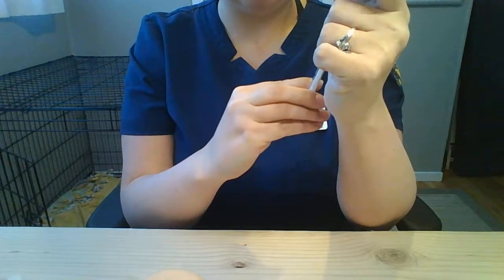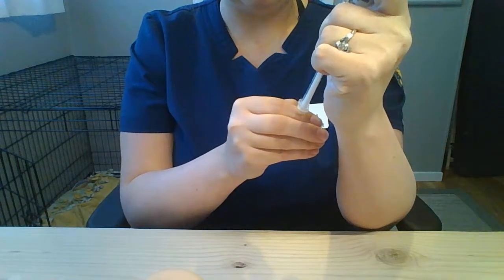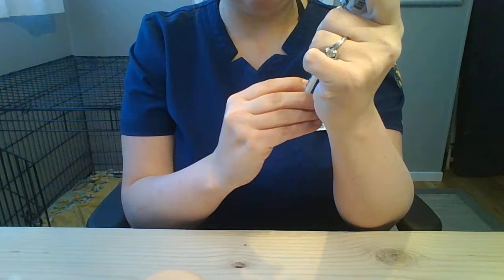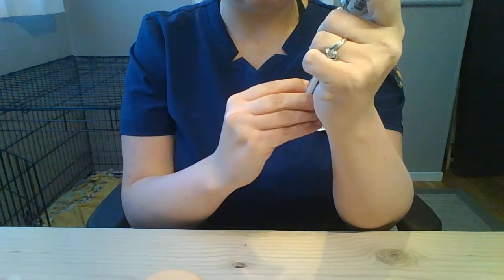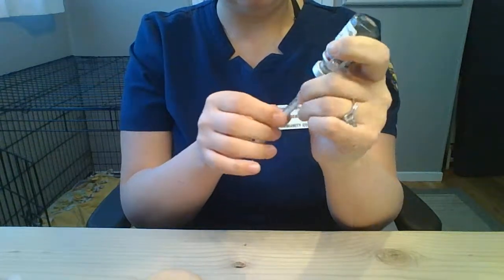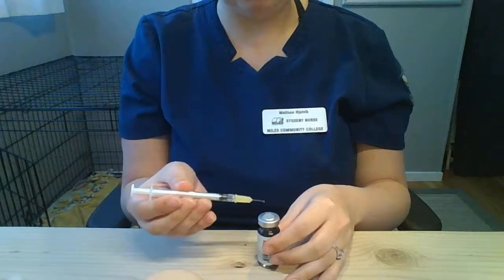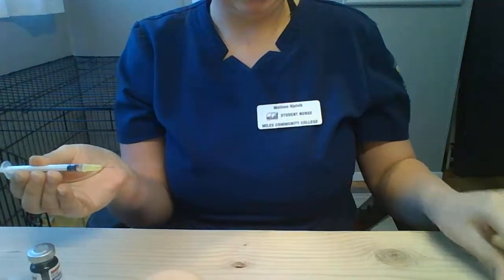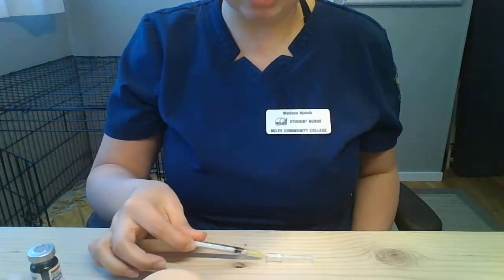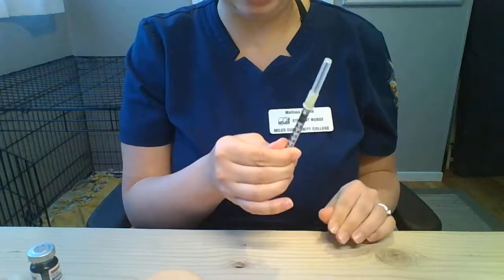being sure to remove any bubbles that may have gathered. So I need 0.1, and I can tap it to make sure all the bubbles are out. Setting the vial down, carefully removing. And to recap, I'm going to use the scoop method with one hand downward and scooping and carefully replacing the cap.